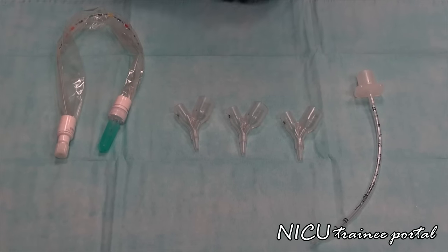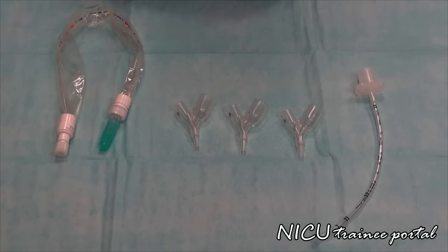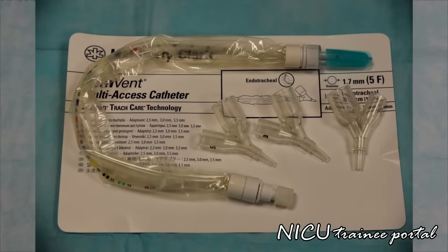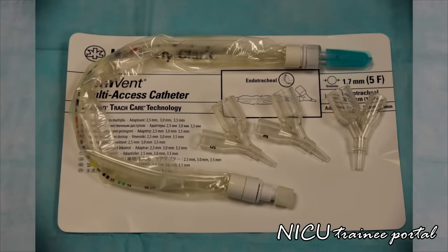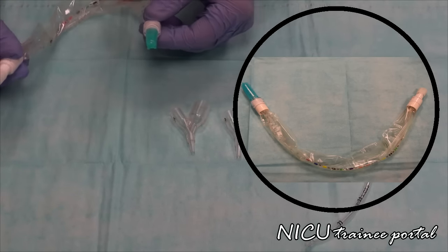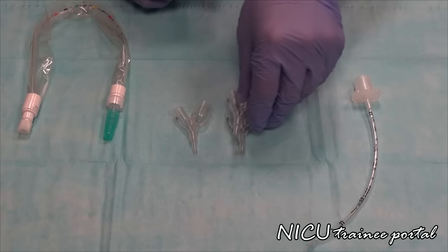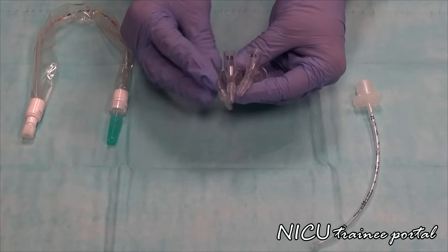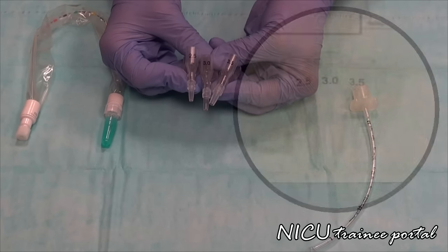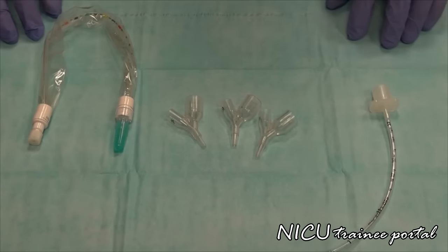In this video we are going to demonstrate surfactant administration through a catheter. Here at our institution we use a catheter kit. The catheter kit comes with a 5 French catheter to administer the surfactant through. It also comes with three different size adapters for the appropriate size ET tube that you will be using: a 2.5, a 3.0, and a 3.5.